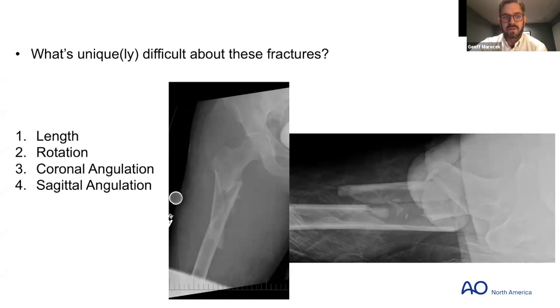You know, we always highlight the flexion of the iliopsoas and the abduction of the gluteals and external rotation. And so if you don't bring that flexion out in some manner, however you choose to do that, you'll have sagittal angulation. If you don't have the right starting point and right trajectory of the nail in the proximal segment, your coronal angulation will be off. And then you're going to be in big trouble. So everything's on high alert, big time, from the very start.